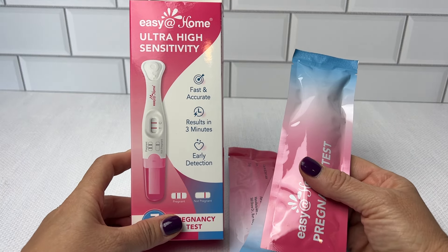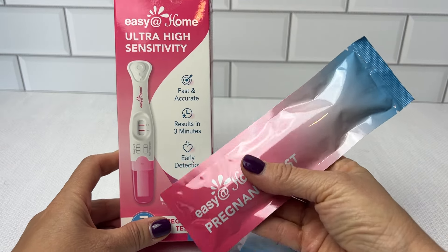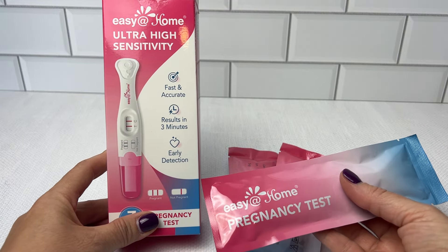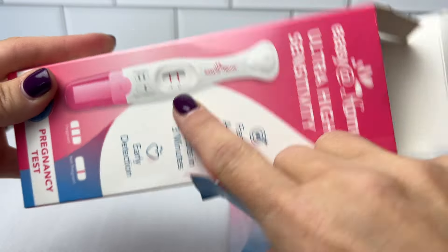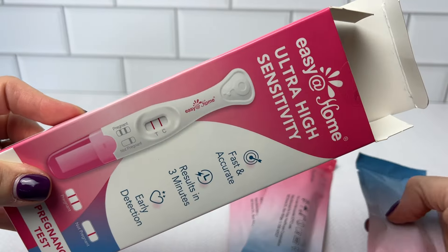What about the results? With the Easy Home Ultra High Sensitivity Pregnancy Test, you really do get them in minutes — results in three minutes, and they're crystal clear. There's no confusion. Two lines means it's time to start planning for the little one. One line means breathe easy.